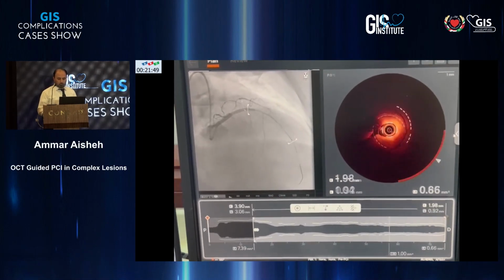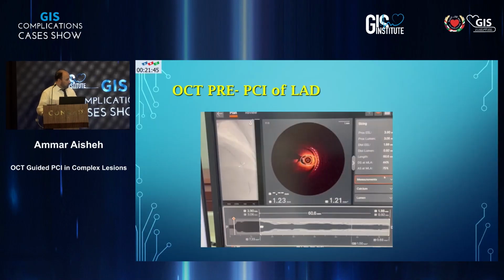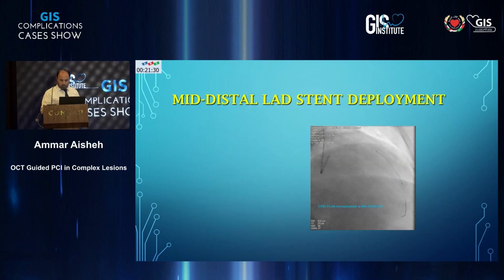Anyway, it's a long lesion with subtotal occlusion, but it's mainly fibrotic. Fibrotic, yes. So it was decided to directly stent the LAD.